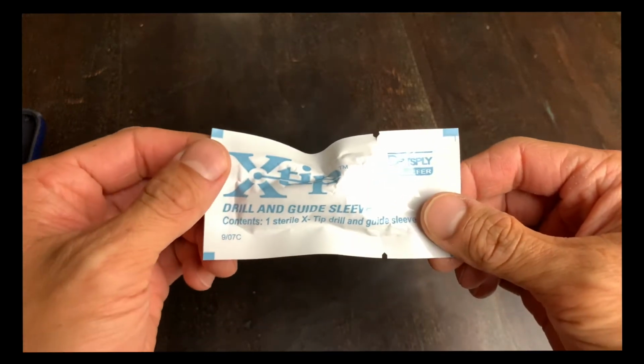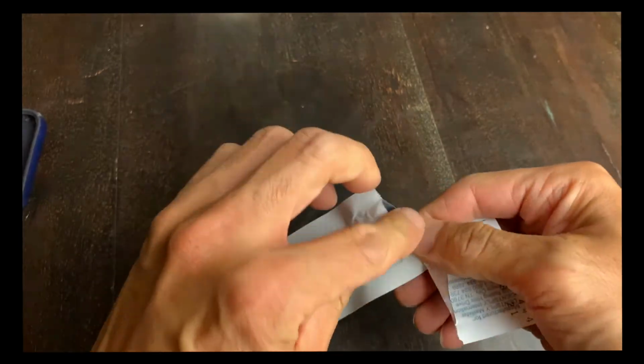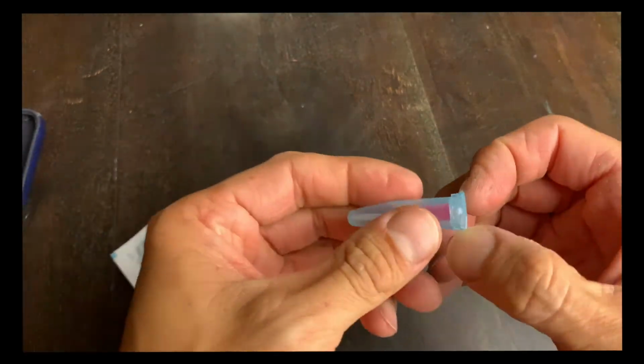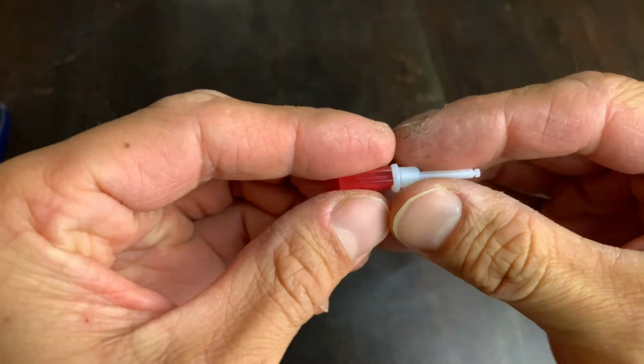Okay, so here's our X-tip, and let's just open up the package. It's some Dentsply. What you'll find in here is just for the perforator. It comes in a little package like this, and you open it up, and here we go. So you use this in a slow speed at 20,000 RPM.